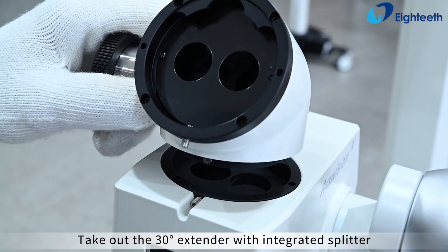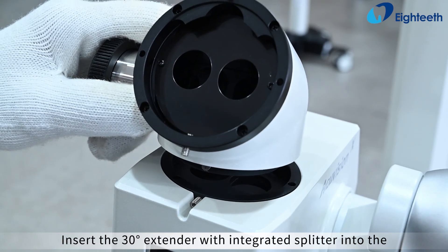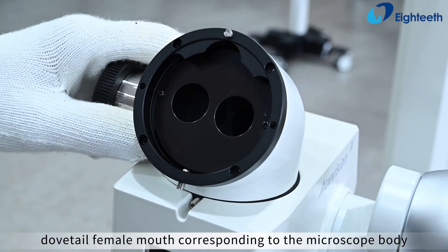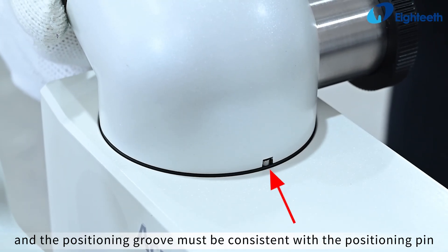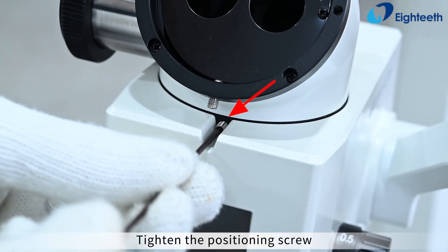Take out the 30-degree extender with integrated splitter and loosen the positioning screw. Insert the 30-degree extender with integrated splitter into the dovetail female mouth corresponding to the microscope body — the positioning groove must be consistent with the positioning pin of the corresponding interface of the microscope body. Tighten the positioning screw.